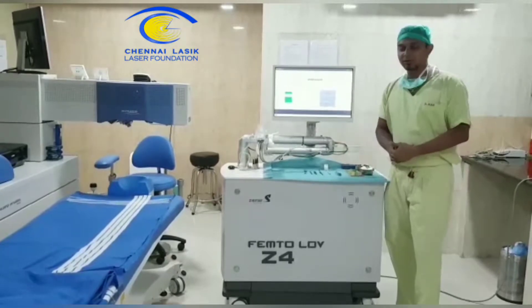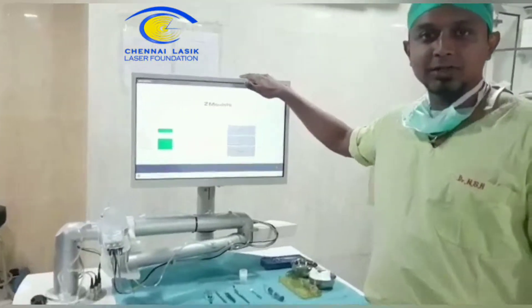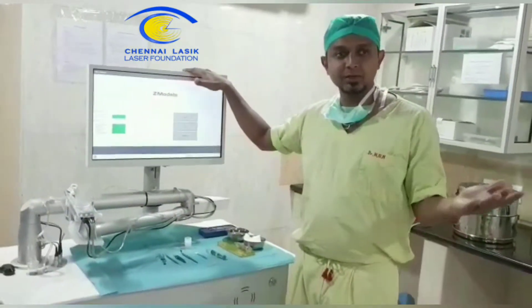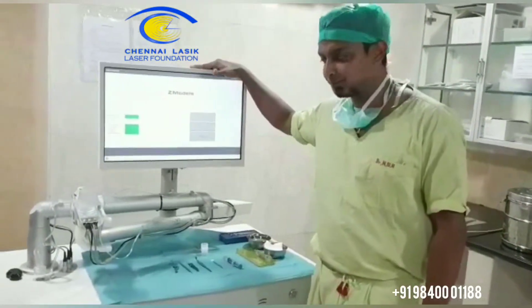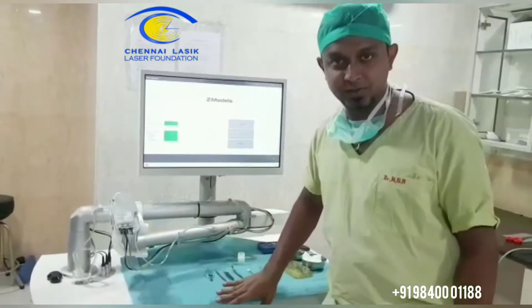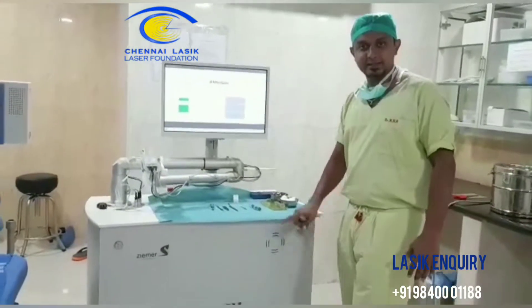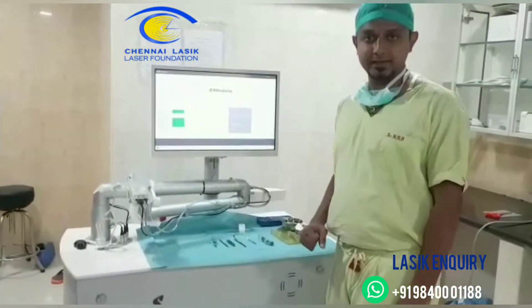This is a small video to show how the Femto LDV actually works. You have all the different cuts here, which is the three-dimensional cut, and then you have the flap hinge and the flap diameter, which can all be changed. Once your assistant opens the flap, there is a reading for every patient which will be scanned, and once the scan and ID is done for one patient, it cannot be changed or used by any other patient.